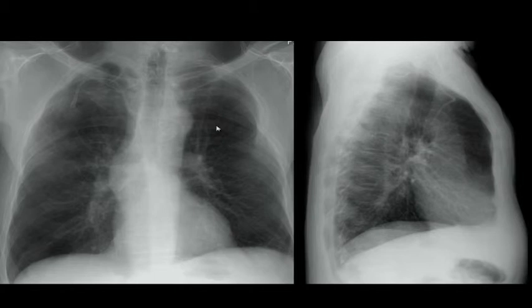Okay, let's backtrack. The diagnosis is malpositioned central venous catheter. So you're on call, I'm your night attending, and this goes down the wrong way, and they're thinking, oh my God, could this be in the aorta? So I look at it and say, no, there is no mediastinal widening. I don't think the aorta has been punctured, because there would have to be a hemomediastinum if the aorta had been punctured like this. But it looks sharp and clean. We still don't know whether it's in the artery or the vein.